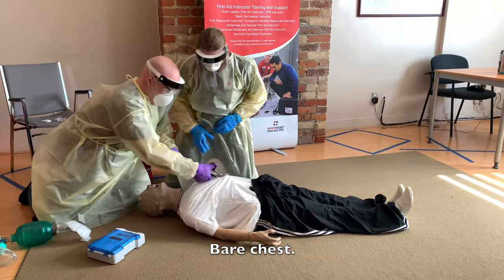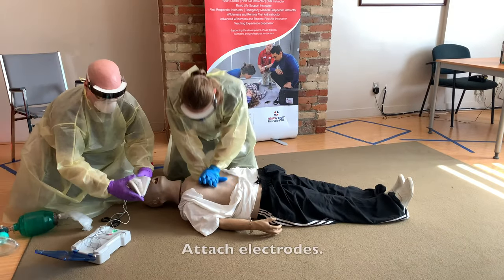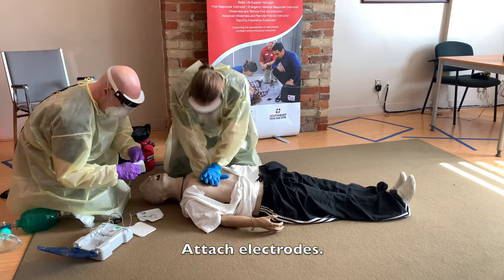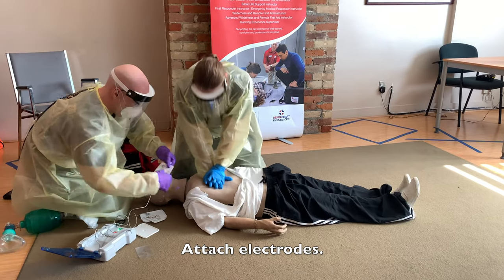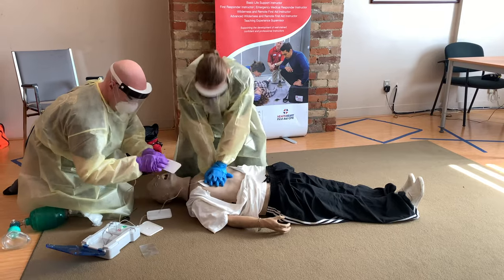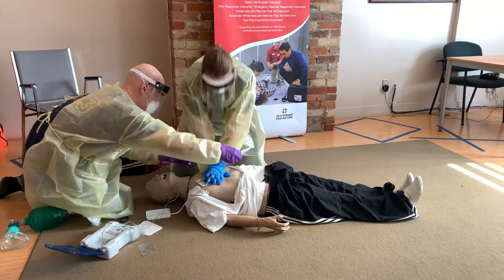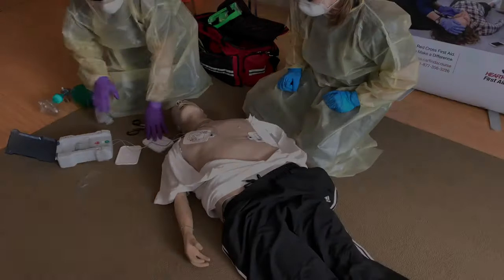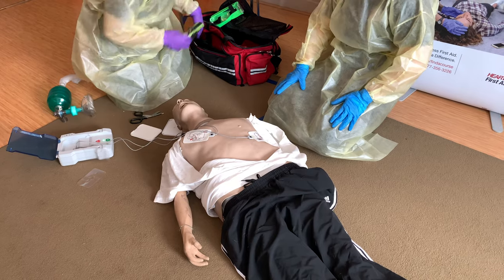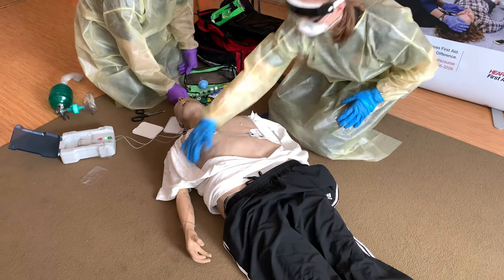Bare the chest and attach electrodes. Open the packet and apply to the patient's bare skin — press the pad firmly onto the skin, as shown in the picture. Press to analyze cardiac rhythm. Do not touch the patient. Analyzing cardiac rhythm — shock advised.